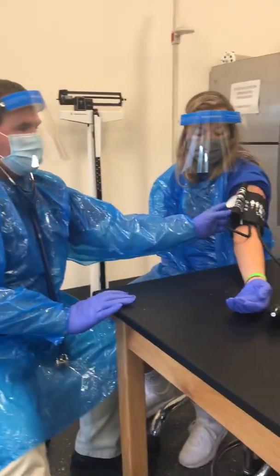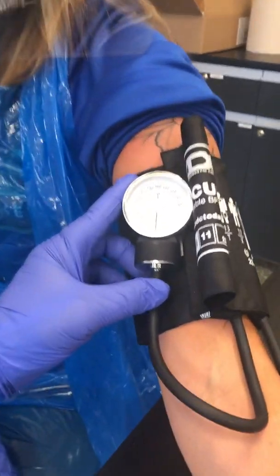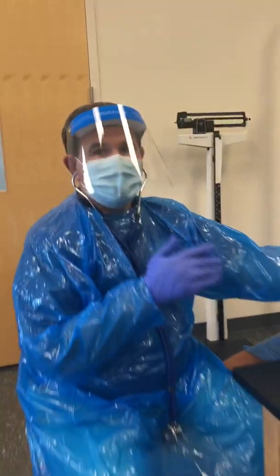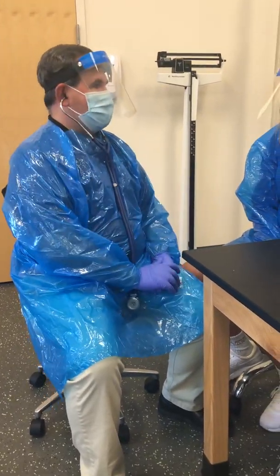If we quickly take a look here, we only have delineations or gradations at even numbers. So if you were to say 115, you're reading between the lines, there's not an indication of what that 15 would be. So we're reading in even numbers.